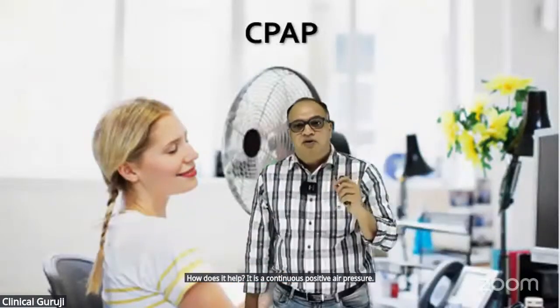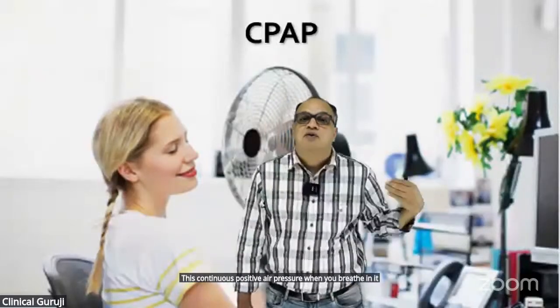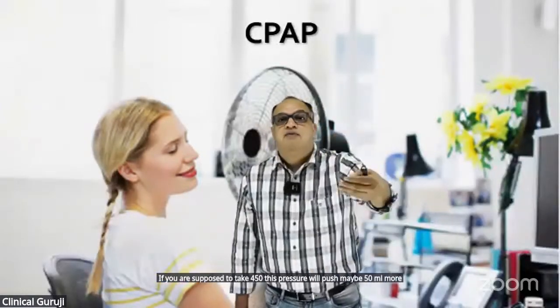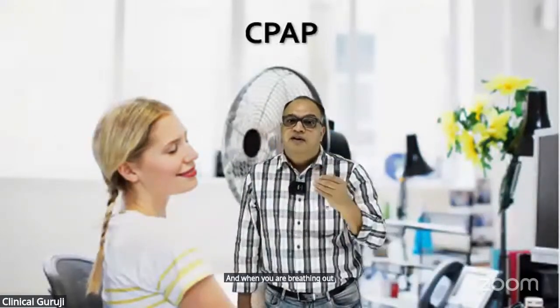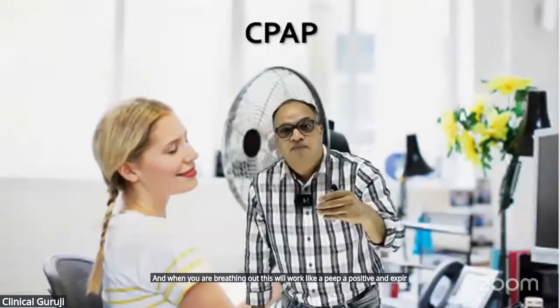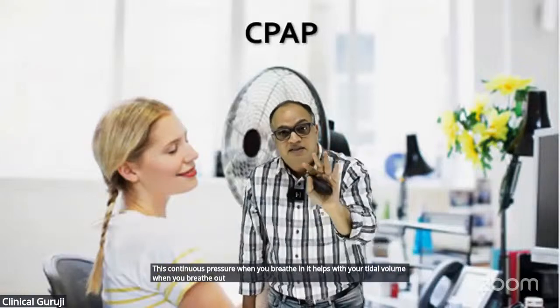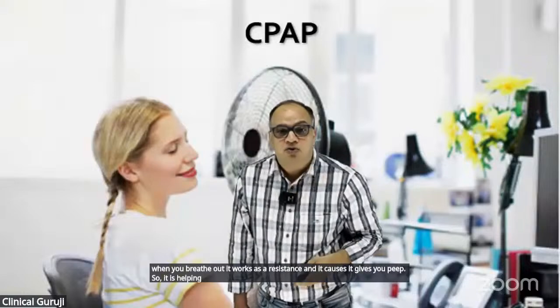This continuous positive air pressure, when you breathe in, helps with your tidal volume. If you are supposed to take 450, this pressure will push maybe 50 ml more and you will breathe 500 ml. And when you are breathing out, this will work like a PEEP, a positive end expiratory pressure. When you breathe in, it helps with your tidal volume. When you breathe out, it works as a resistance and it gives you PEEP. So it is helping both ways.